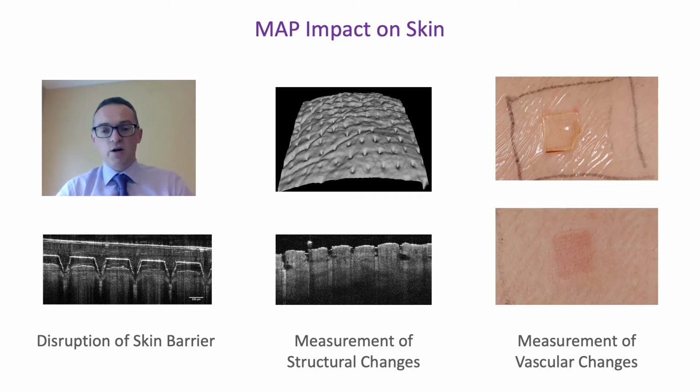We can see some examples here of the microneedles inserted in somebody's skin, and then the skin after the microneedles have been removed, indicating that yes, we are creating pores in the skin. The little micrograph here shows a patch in place under some occlusive film on a person's skin, and then the mild erythema that quickly resolves on the surface of the skin after the microneedles have been removed.